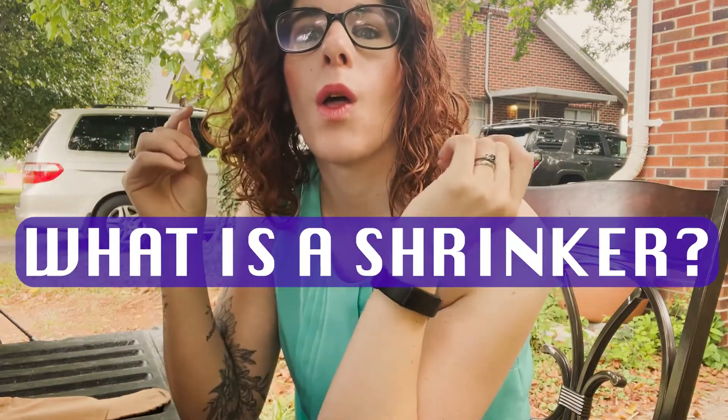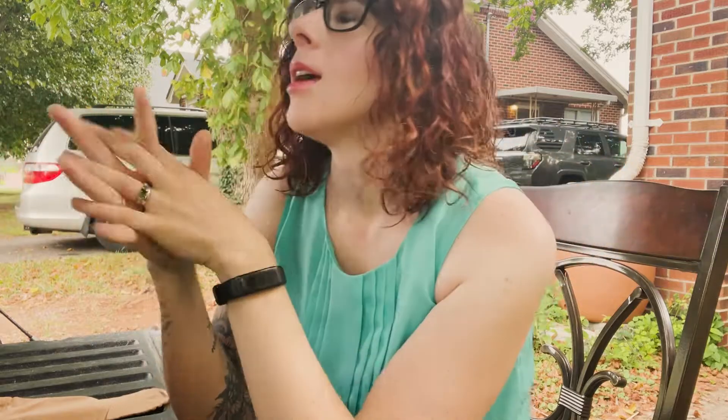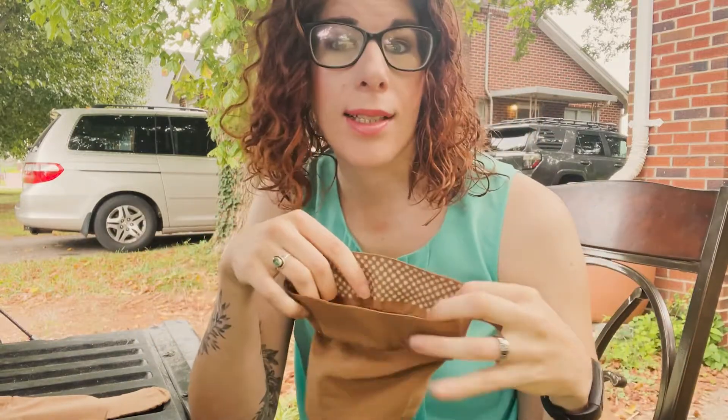Shrinker socks — when it comes to shrinker socks, there are a couple of different types, sizes, and they come in different compressions. What is a shrinker sock? It's basically a sock of elastic, stretchy material that does a couple of things: it offers compression, it facilitates healing of the residual limb following amputation surgery, and it also helps shape the limb to a certain degree.